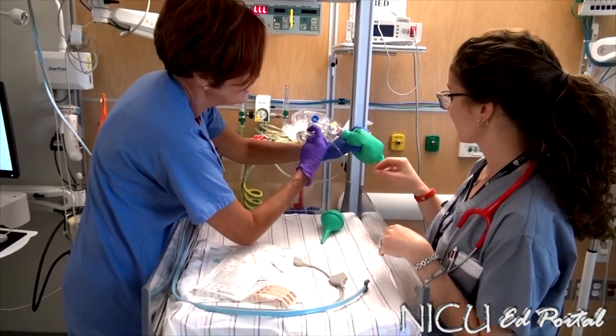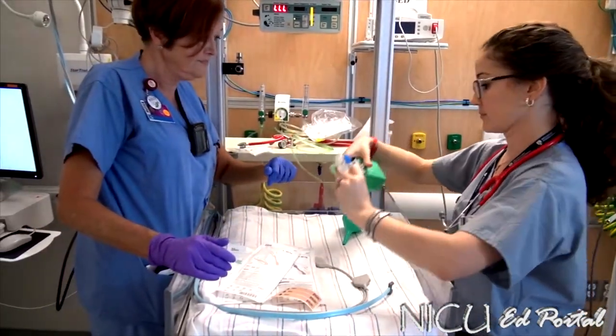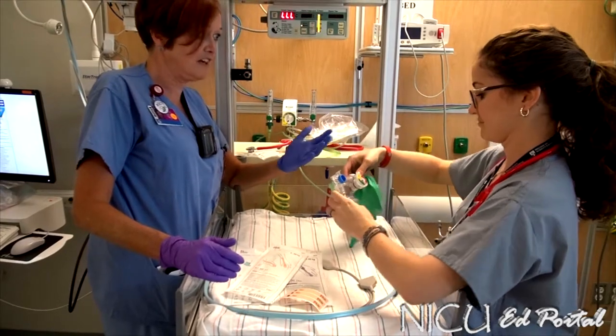So assuming you've got a good seal, your first CPAP is going to be about 5. If you want to practice giving pressure, you can see you can go from 5 to 20 pretty quickly — just try that right now. Your bag is ready.